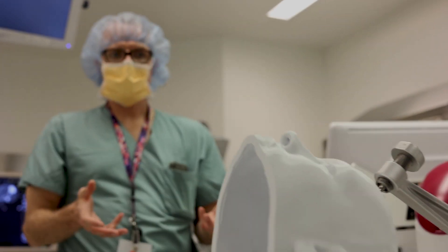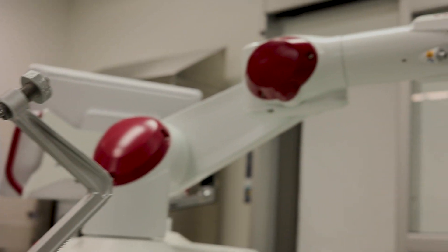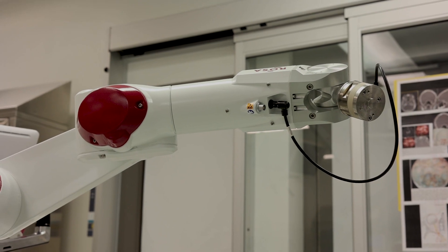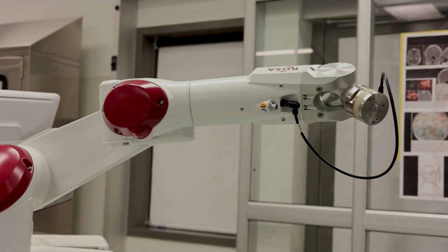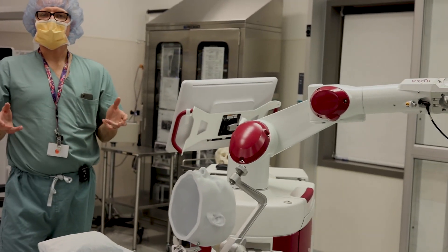We wash the patient's head — we don't shave or cut any hair — we wash the patient's head and forehead and around the ears, and we drape the patient with sterile drapes, and then we're basically ready to go. So we would do what we call drives to the first electrode.